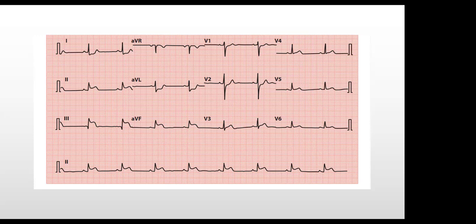So what do you think? So again, sometimes the evidence is what matters, because you can't just make a diagnosis without supporting evidence. Okay, so tell me.